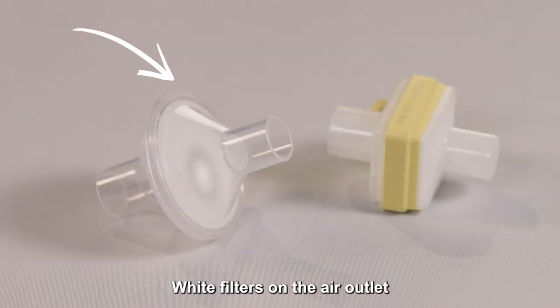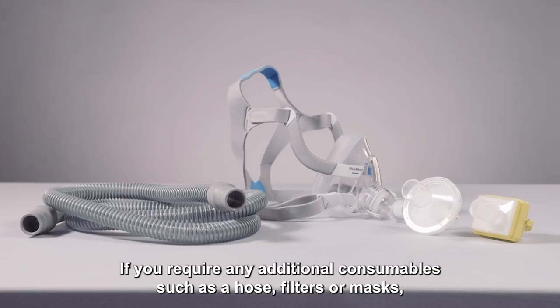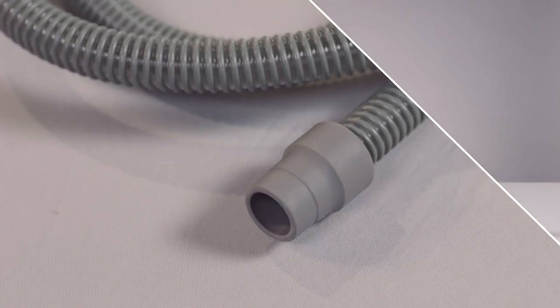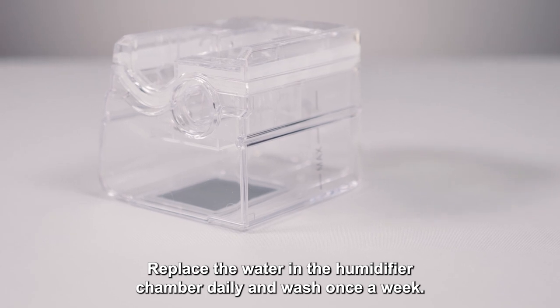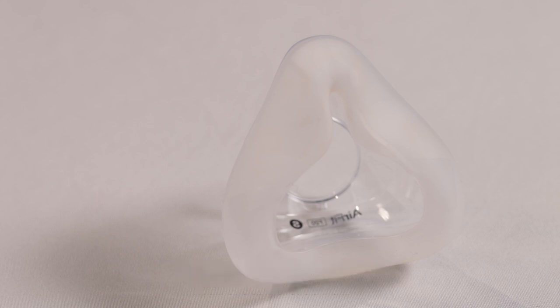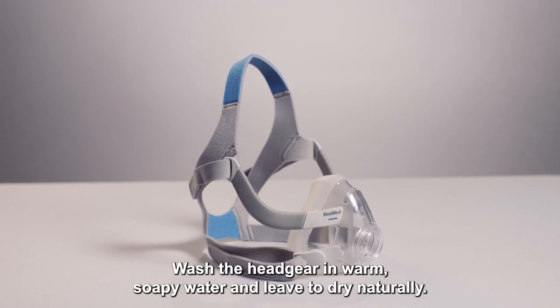White filters on the air outlet should be changed weekly. Yellow filters used with humidification should be changed daily to prevent being blocked by moisture. If you require any additional consumables such as a hose, filters or masks, please contact the home and IV team on the contact details below. The hose should be washed weekly in mild detergent, rinsed in clean water and left to drip dry over a shower rail or door. Never use bleach to clean the equipment. Replace the water in the humidifier chamber daily and wash once a week; however, don't use any harsh chemicals. Wipe the inside of the mask with a damp cloth daily. Do not use baby wipes as this can damage the seal. Cleaning the mask daily will help to achieve a good seal and prevent the mask moving around. Wash the headgear in warm soapy water and leave to dry naturally.